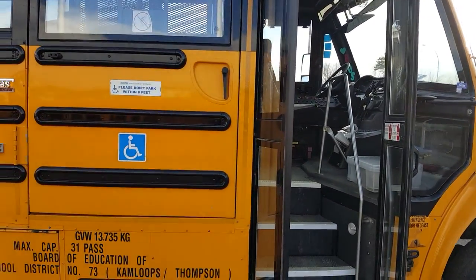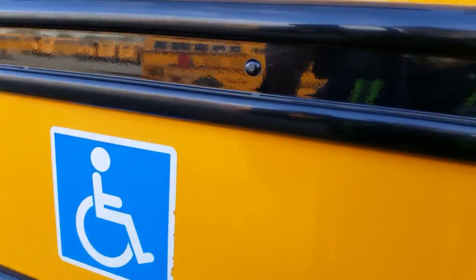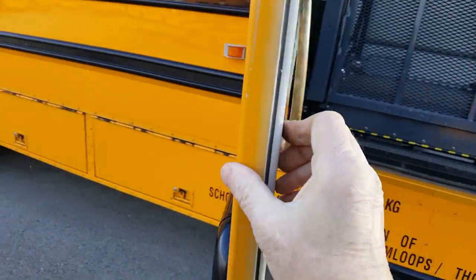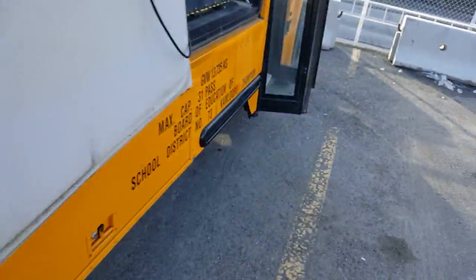Now we're looking at a wheelchair bus — you can tell by thekal. Let's open her up, there's a safety chain for that door. Rather large door, okay.